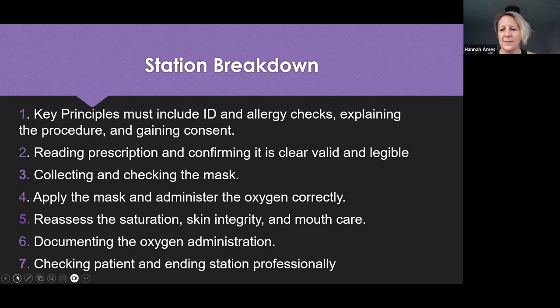We're going to apply the mask to the patient and administer the oxygen correctly. I'm then going to do my reassessment: reassessment of saturation, reassessing skin integrity, and offering regular mouth care.